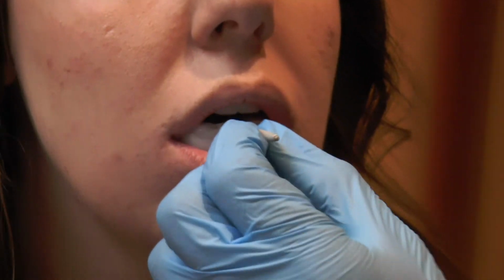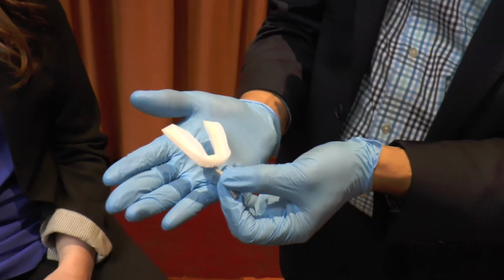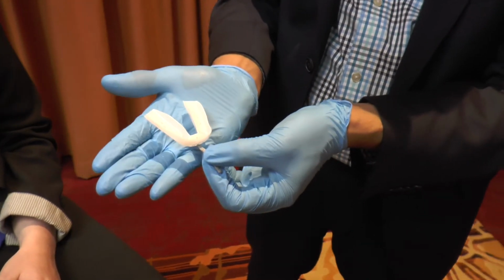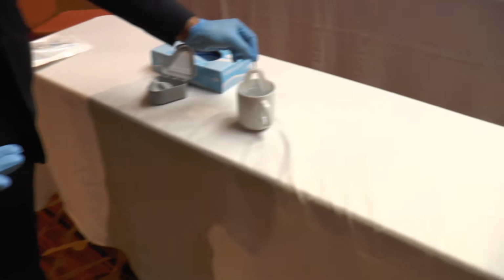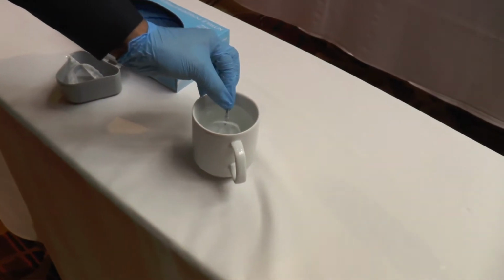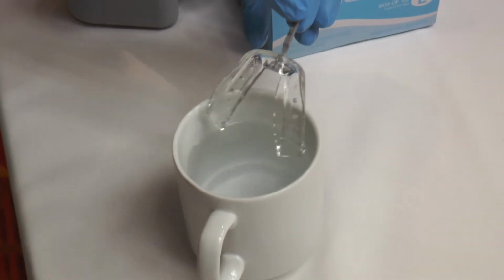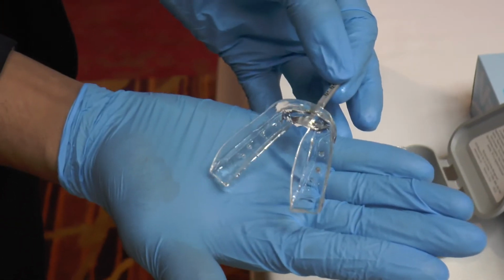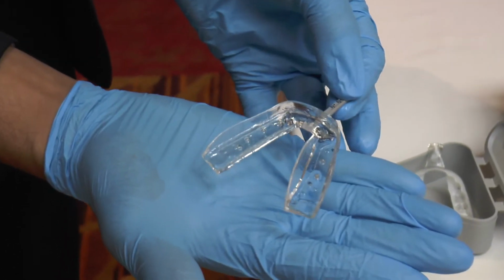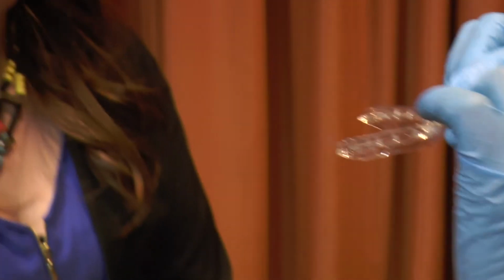So our next step, go ahead and open, is to place this in some warm water and get it to return to that clear state as demonstrated previously. So as you can see, you've now taken a tray that looked white, and after soaking in some warm water, it goes to this clear state, which is time for you to insert it in the patient's mouth. Now with this lower tray, one note of caution is the tongue.